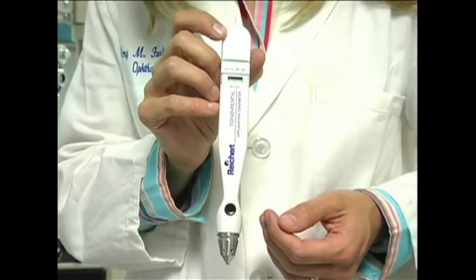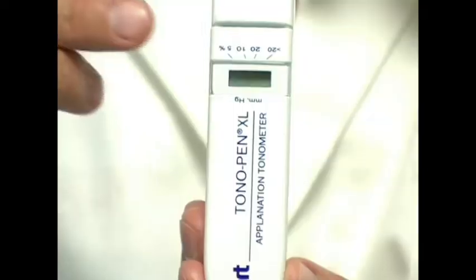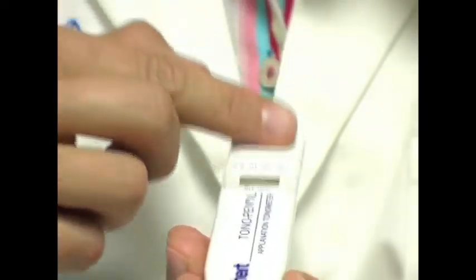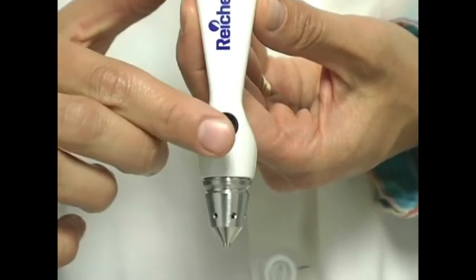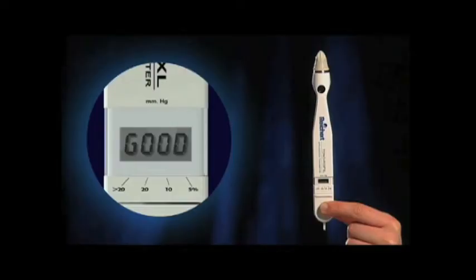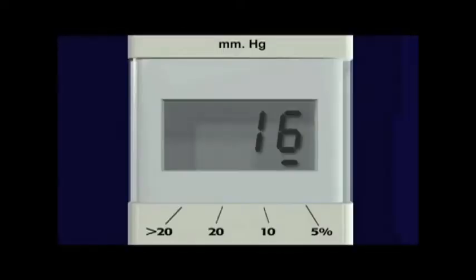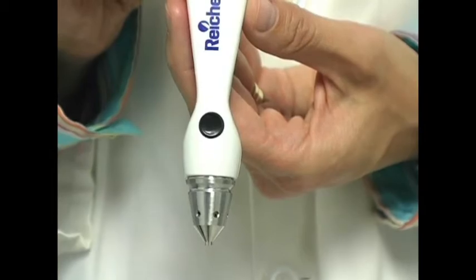The parts of the tonometer are the transducer tip, the operator button, and an LCD display. Do not touch the transducer tip, as it is very sensitive to dust and oily residue. The operator button is used for calibration and to start the pressure measurement process. The LCD screen provides information about the calibration process and also tells you the pressure reading. The Tonopen is simple to use if you follow the proper steps and timing sequences.